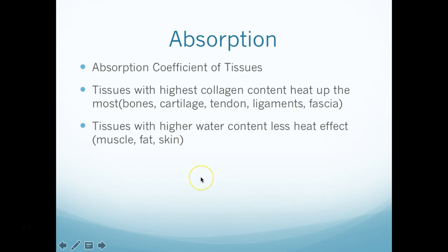So thinking about absorption and the sound head creating heat, you want to be a little bit careful about a bony area, as far as not having it heat up too fast and causing what we call a periosteal burn.